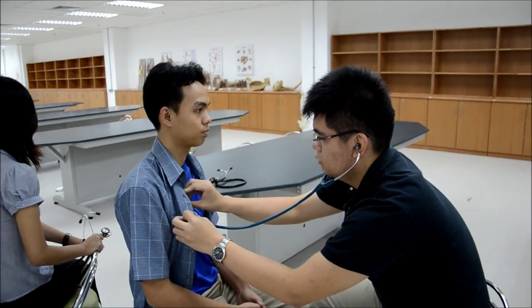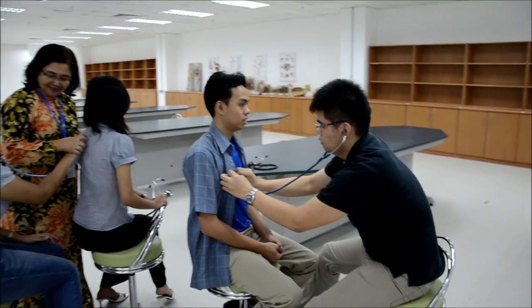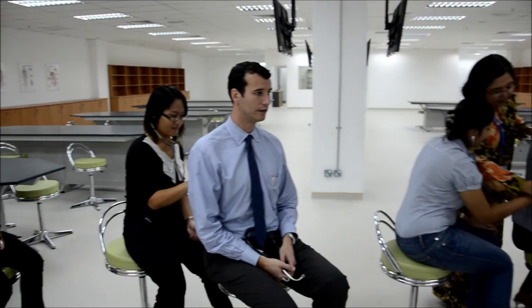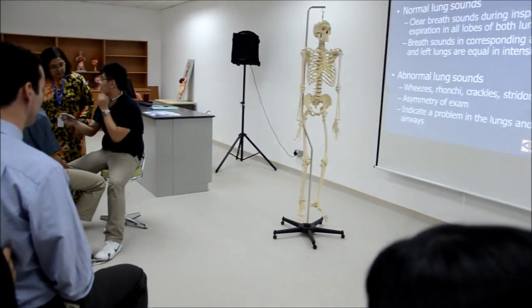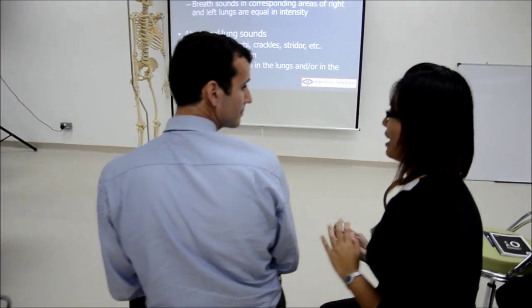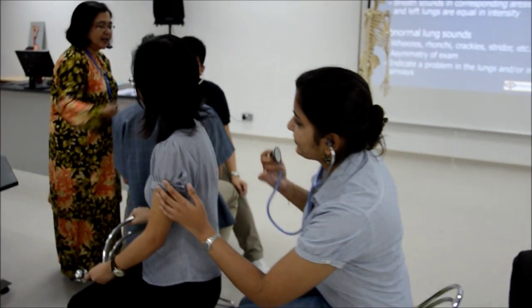Now compare this versus now try the back. Can you take a deep breath with your mouth? What do you hear better? Do you hear inhalation better or exhalation? Okay, breathe in.